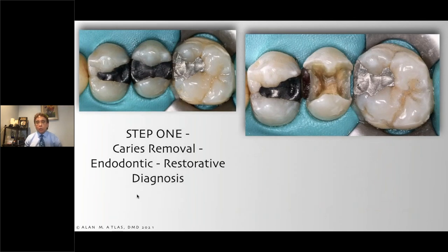Probably going to need endodontic treatment. We do the caries removal. Again, that's my endodontic diagnosis. I've done my endodontic diagnosis. My restorative diagnosis is that the caries was not going deep. It was there under the restoration, cleaned it out. No pulp exposure, but that's okay.